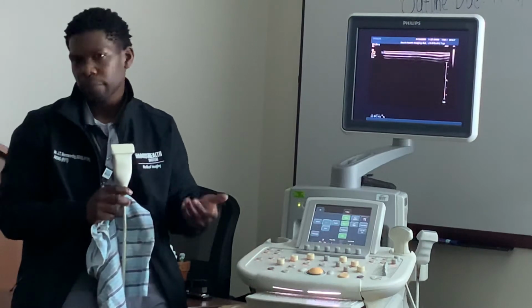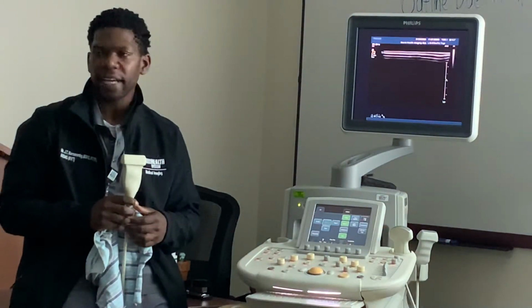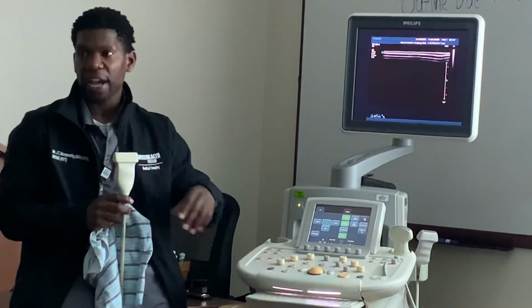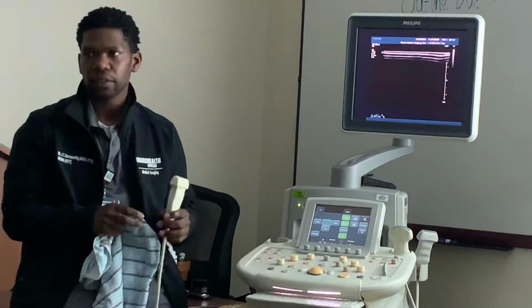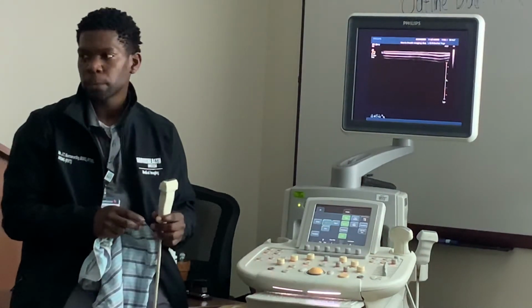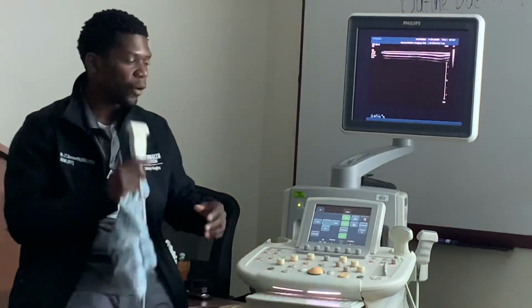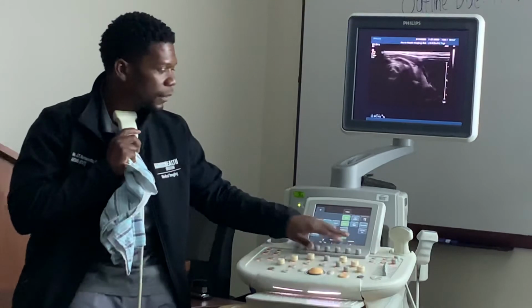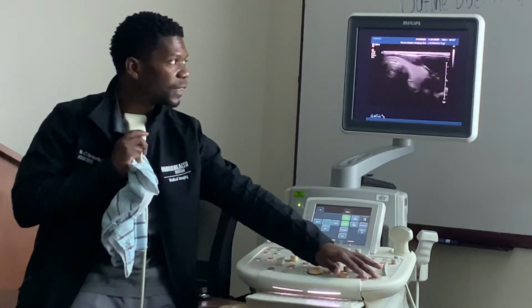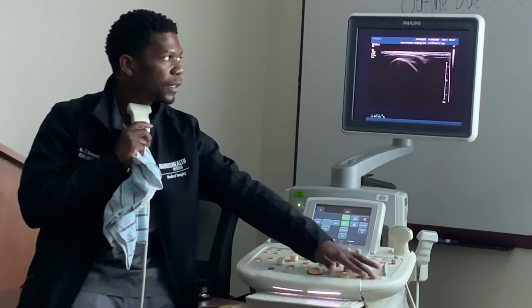Does it have something to do with the grays as well? It's going to change your whole image. As you move your transducer, it does it automatically. It does the compression, the amplification, all of that. It works just like if I use iScan. If I use iScan here, it's going to optimize my image.